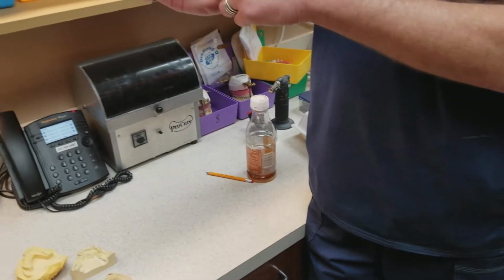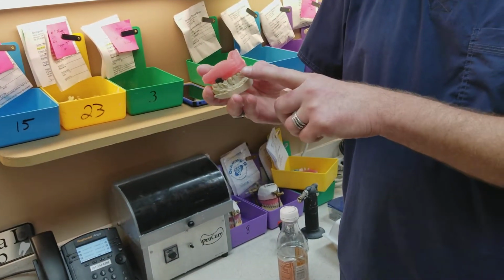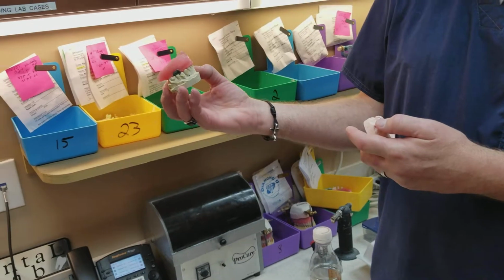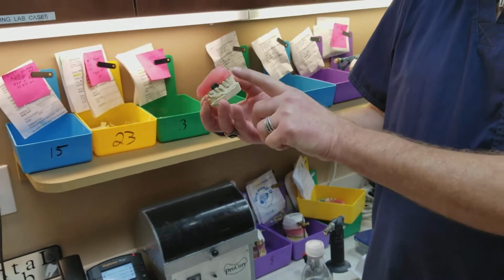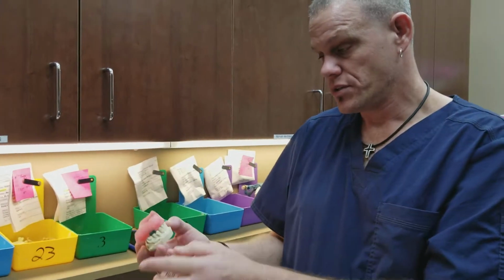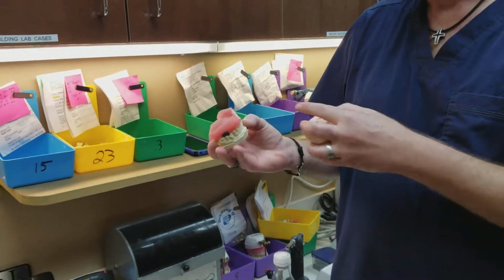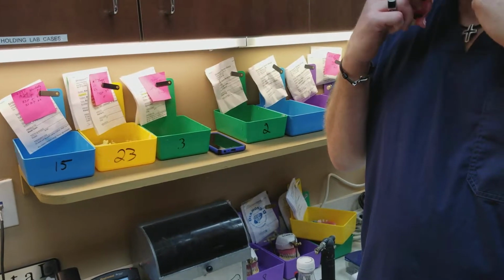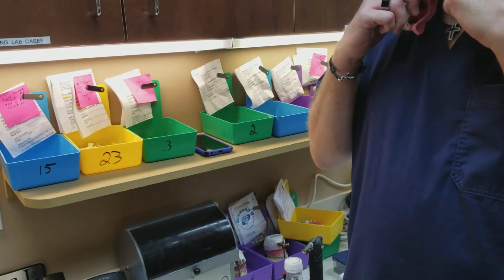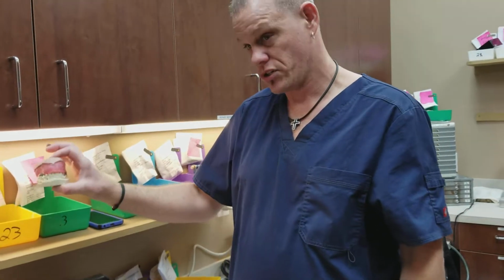I take my time on these. So, like if you're working with your doctor, make sure they take their time, and that everything lines up good, because they just don't want to slap a bunch of blue mousse in there where you can't see what's going on in the front. So you want to be very shy of that. I make little notches in the back, and that's where you want to squirt it in, have them bite down. Make sure that they don't move from side to side, so you hold their cheeks, and make sure they're not protruding. And that's a correct bite. So when it comes out, it should look like that.